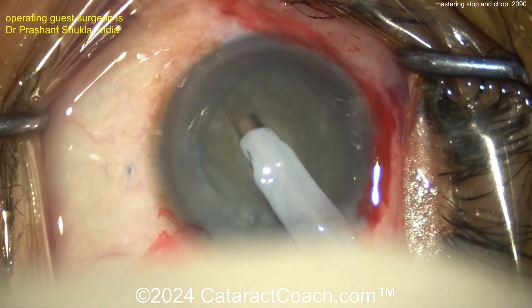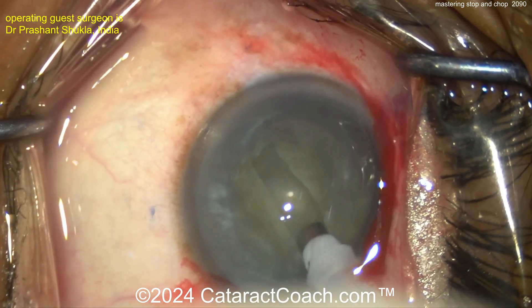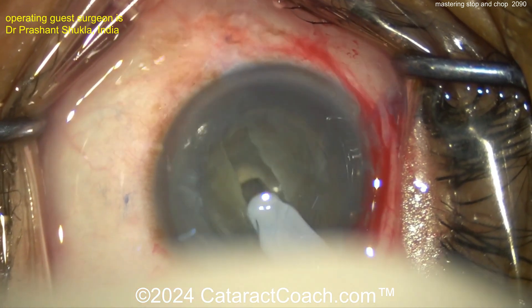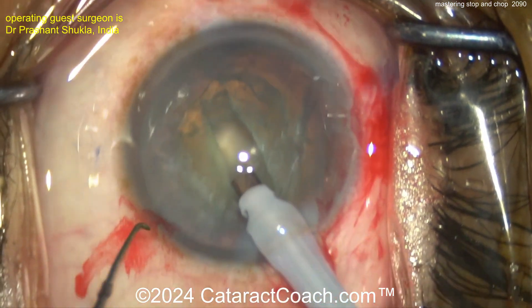Remember, the lens is shaped like an M&M candy. Right in the center it's thicker, and towards the periphery it becomes thinner. I like the idea of a little bit of extra grooving in the very center, in the very deep part. That looks great. Now, you don't have to go all the way through — you don't have to have 90% depth as a groove. You can have just a little bit more than half, and that should be enough to split it.